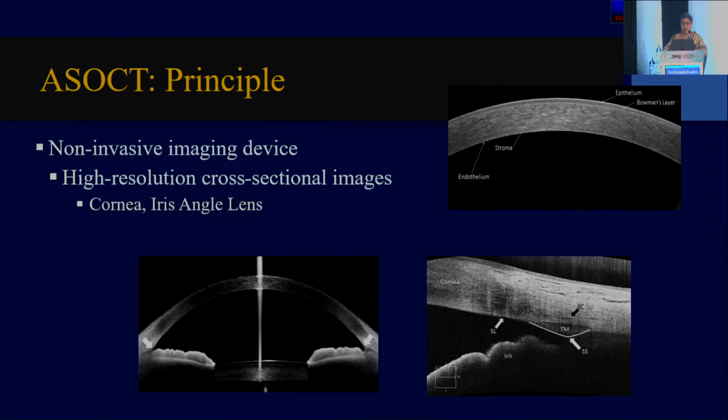Coming to the anterior segment OCT, it's non-invasive and it gives you high-resolution cross-sectional images of the cornea, the iris, the angle, and also the lens.